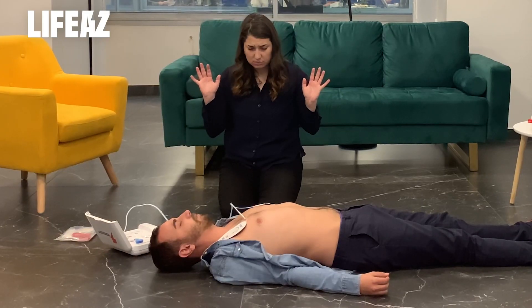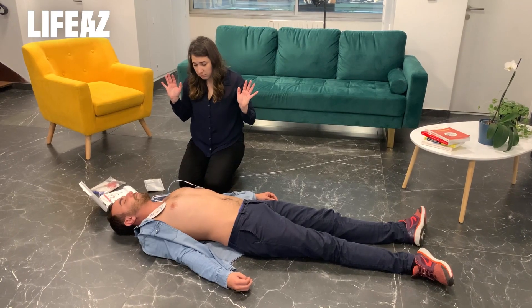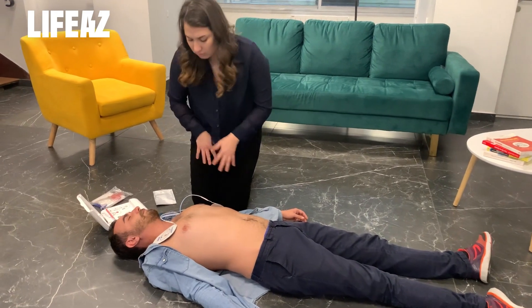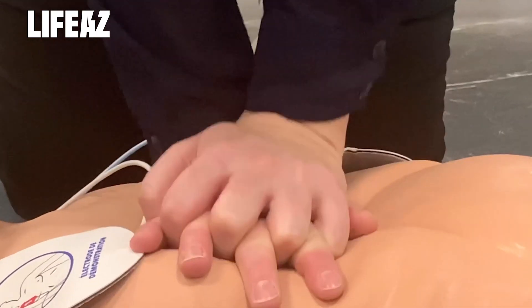Do not stop CPR until emergency services arrive or until the defibrillator announces a new analysis. Your Clark defibrillator stops every two minutes to analyze the victim's cardiac rhythm and decides if another shock is necessary or not. All you have to do is follow Clark's instructions.